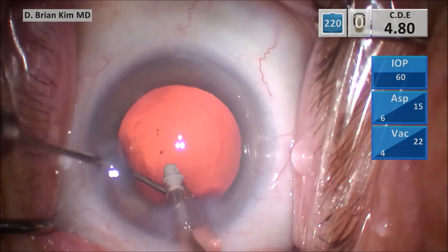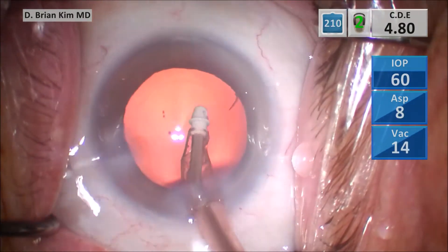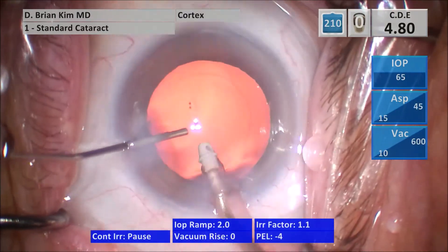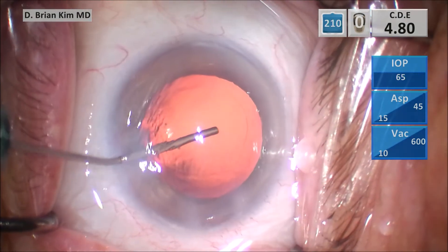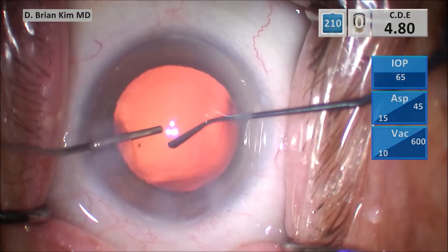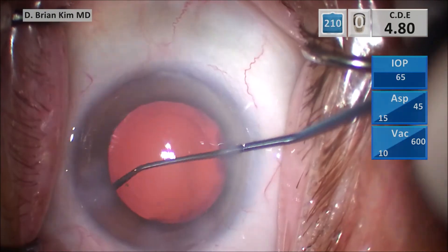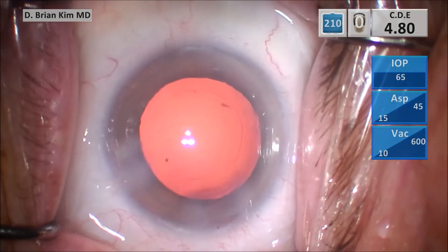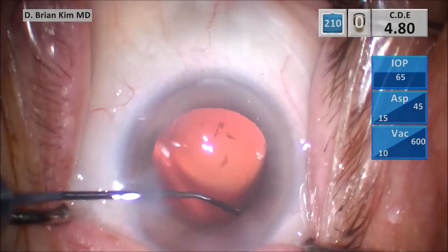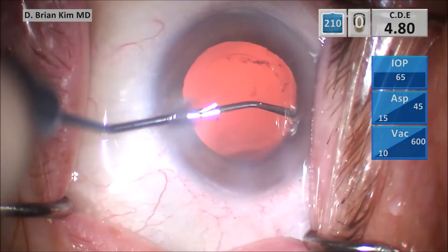Pulsing into the sub-incisional capsular fornix just to look for any adhesions of cortical material — and there is. You can see there's some fine wispy lens material that's coming out. This is cohesive viscoelastic. I'm going to switch to cortex mode and then turn off irrigation. When I turn off irrigation, I fill the eye with viscoelastic — if you have irrigation on, all it will do is cause a pressure head and cause the viscoelastic to shoot out of the eye. So I like to turn off continuous when I push the viscoelastic to fill the capsular bag. Sweeping underneath the rhexis edge, first on the left side and then the right side — you can see how much water there is there, pooling and obstructing the view.